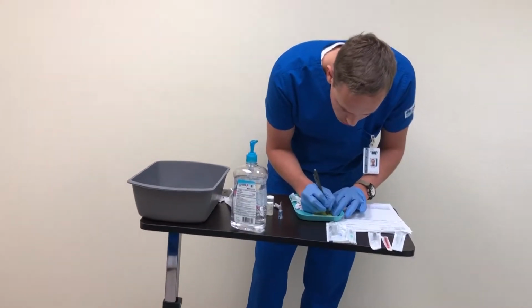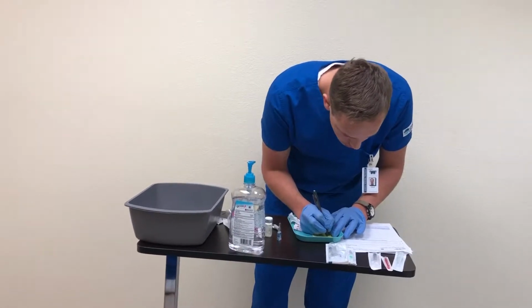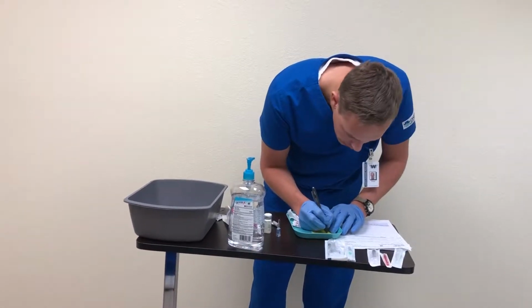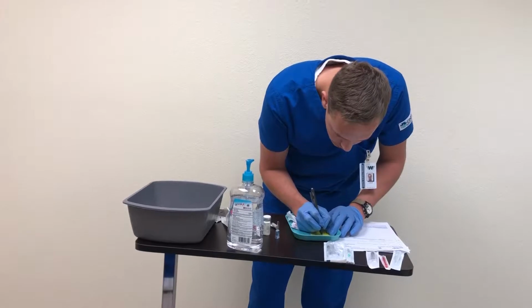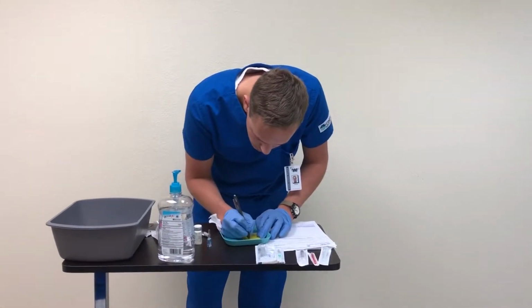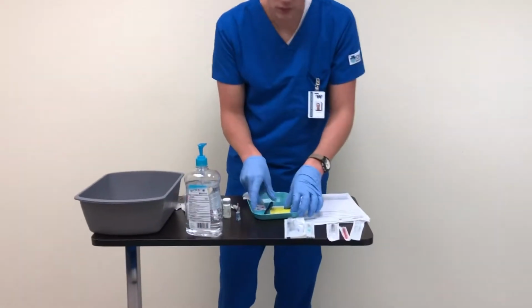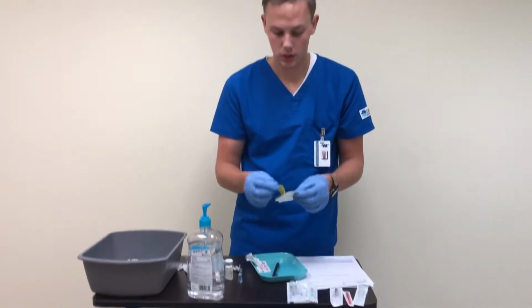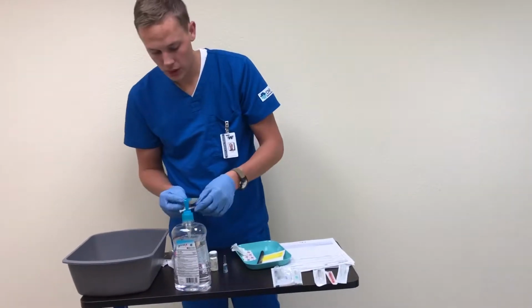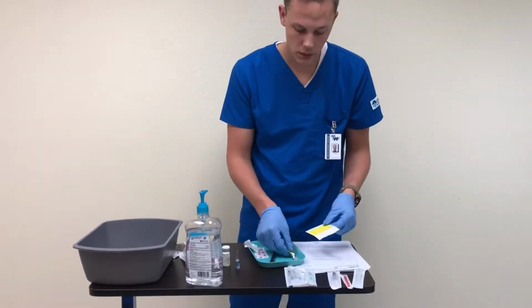And I'm gonna initial and give the date and time, which is at 9:30, and then today's date is 10/4/19. And then we'll just put that around the needle, and so that one's ready to go.